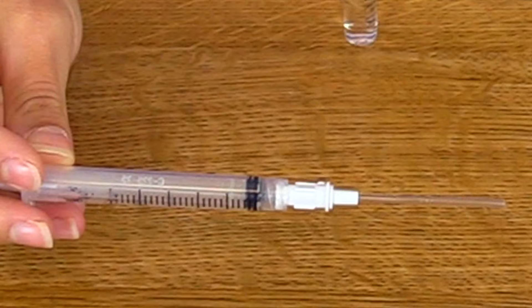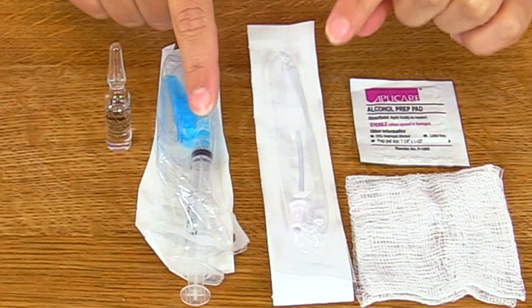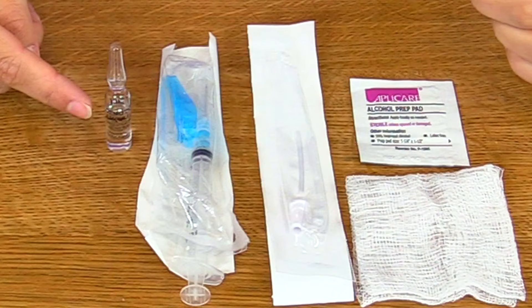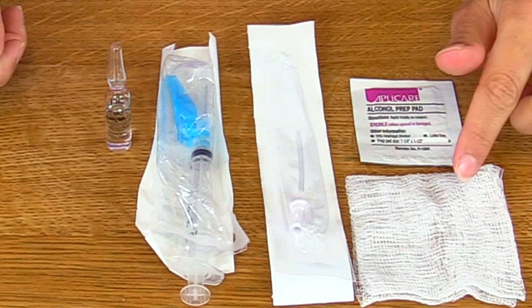Pick the size accordingly. Just like its name says, it's a filter straw. We're going to attach this device onto our syringe whenever we withdraw the medication out of the glass ampule, because it's going to help prevent us from possibly withdrawing any glass particles that could go to our patient.